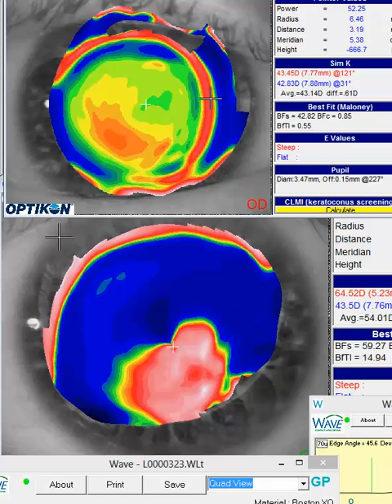having defective optics. On the other hand, as you know, this is a very, very complicated cornea with a lot of steepening through there. We also look at your topography, and we're missing a lot of data down here just because of the positioning of that cone. So some of these are really hard to get great topographies. We end up extrapolating a lot of data in here, and it could be possible that the lens that came out of this design was so complicated with the optics we ended up with some weird optical effects.